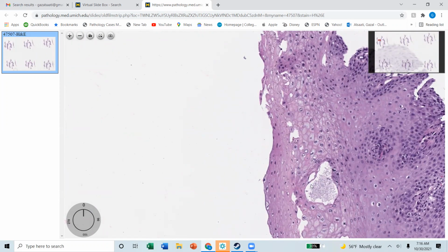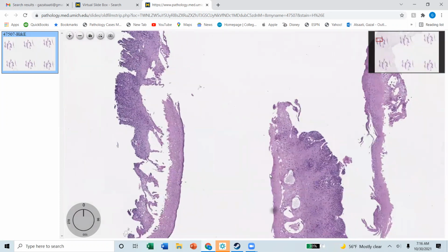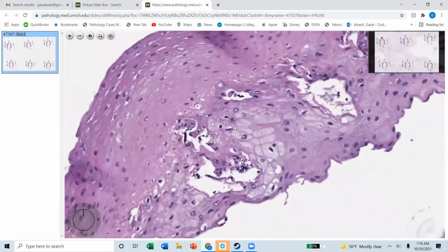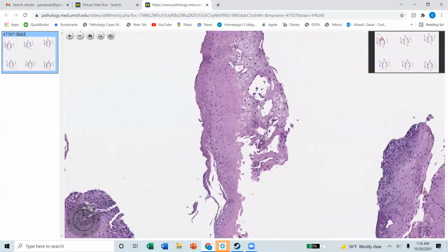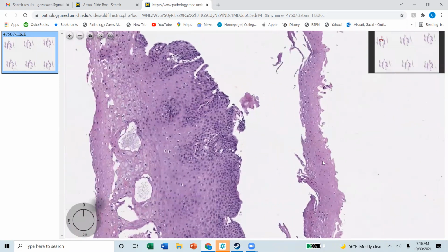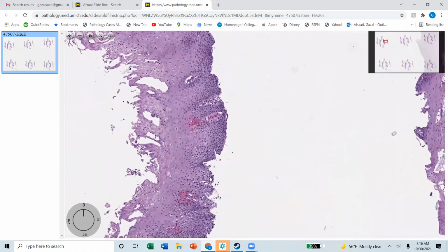In between, yes. You have to have a nice top area on top of the sloughed area to call it. Got you. Even this one, if you want, this one doesn't have a lot of anucleated squames at the top. But then it has a zone of separation kind of thing. Correct. Let's screen everything.